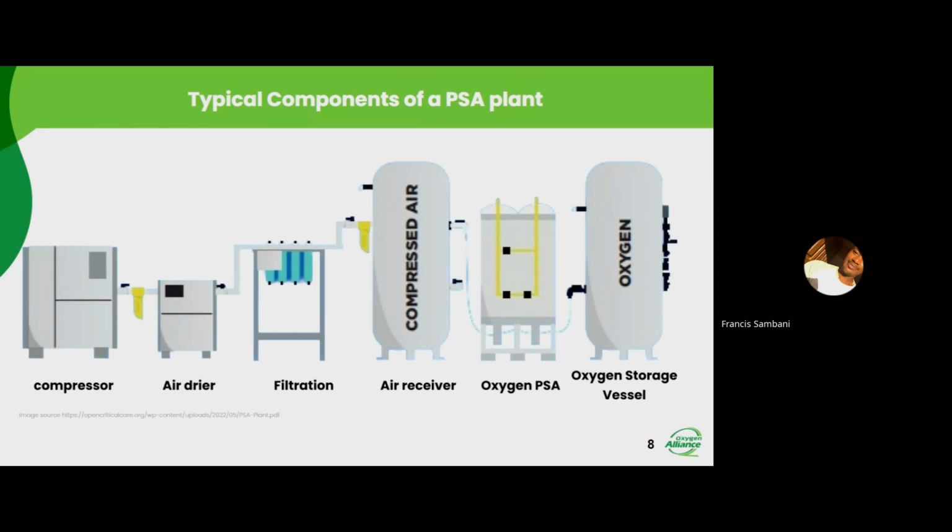What you next do is you can now remove your cylinders, and once you remove your cylinders off of the manifold, you cover the end of the pipes which fit to your cylinders with a plastic to make sure that you don't have dust accumulating on those areas. So that's how we shut down. This is not a complete shutdown, but if you're shutting down, you then go backwards.